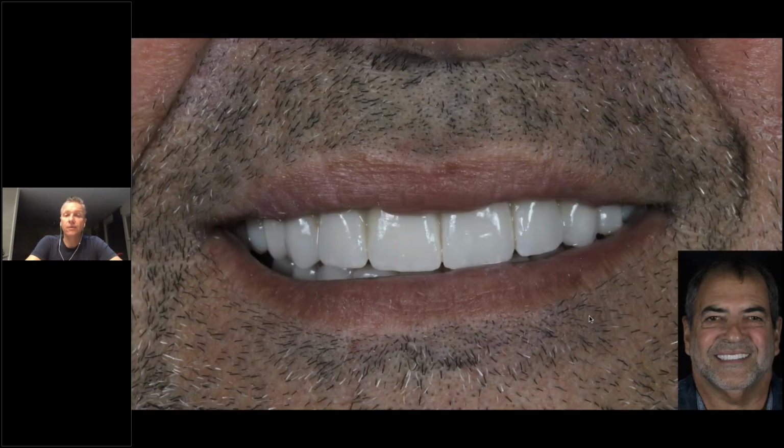So we had to play a lot with shapes and contours of these teeth to create a very natural smile, and that's absolutely not straight, but that's on purpose. Just look at the lower lip. So we had to basically balance aesthetics here, and then we see here the final zirconia layered REAX bridge. So that kind of goes towards the end of our presentation.